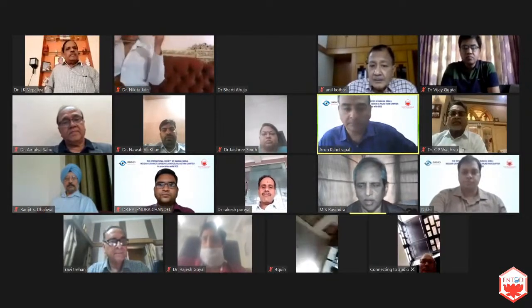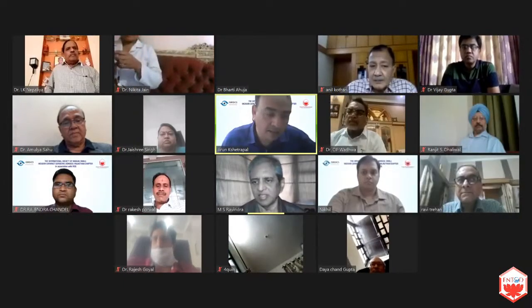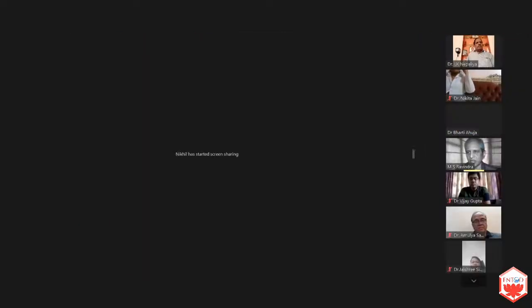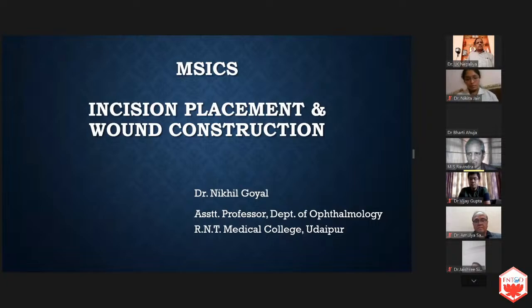Yes, sir. Arun, as they are starting, I would like to comment on 2 points here. Whenever you take the measurements, either K reading or autorefraction, it is always mandatory for the patient to close the other eye with the hand and look at the target. If the patient is not looking at the target, all your values are wrong.